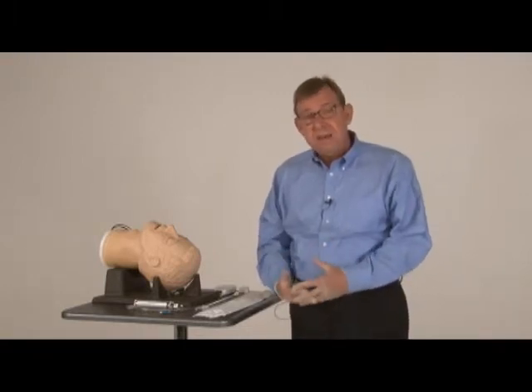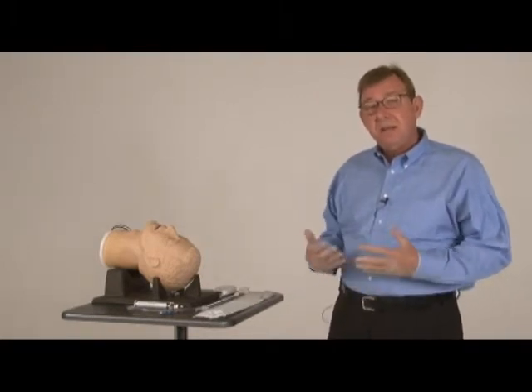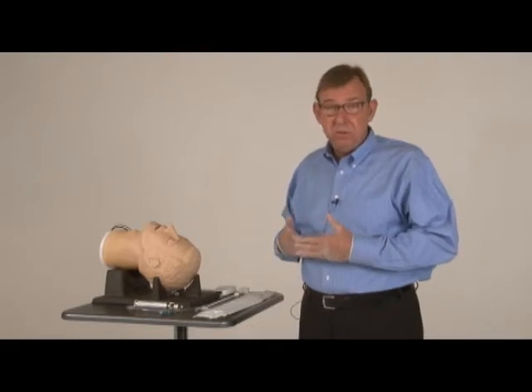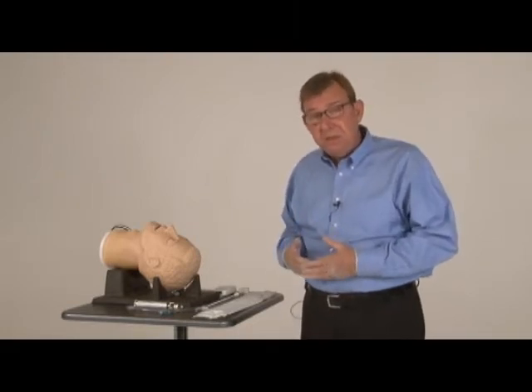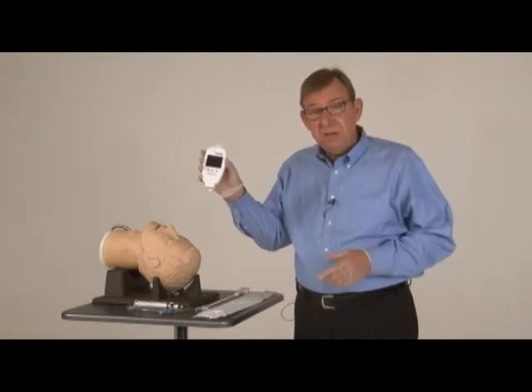The ViewStick is a fast and remarkably easy-to-use video laryngoscopy device that allows the clinician to actually see what the end of the ET tube would see. It consists of two pieces. One is a very lightweight and rugged 4-ounce video handpiece.